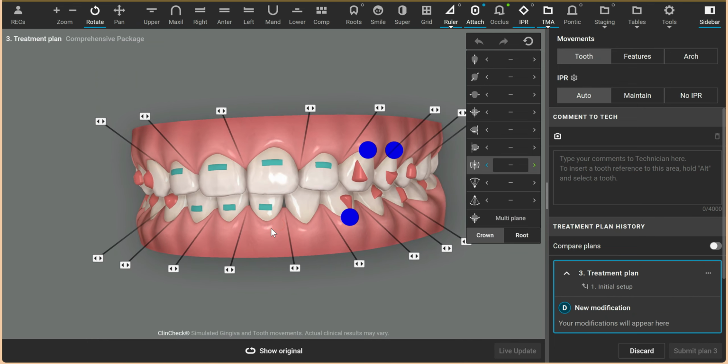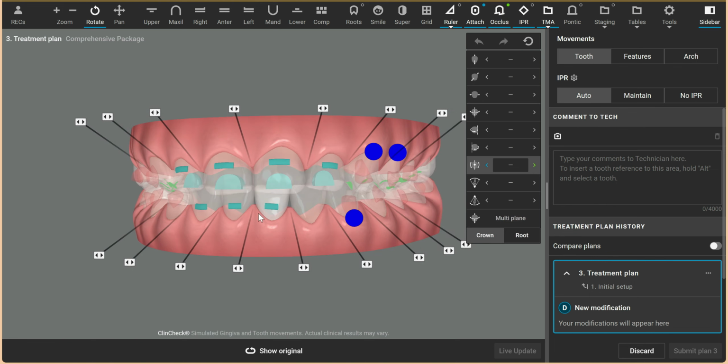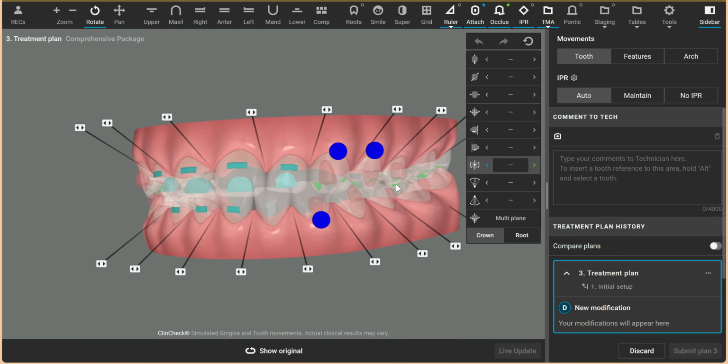These kinds of cases are fairly easy to finish with premature contacts and a posterior open bite after the initial set of aligners. So I wanted to show you something. First of all, there are no anterior occlusal contacts. Even though it looks really tight here, you don't see any green marks. But I want to show you something.